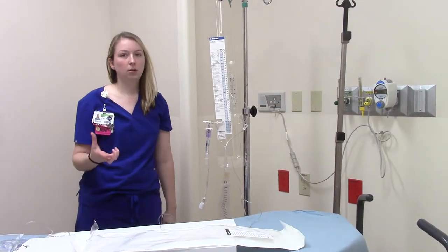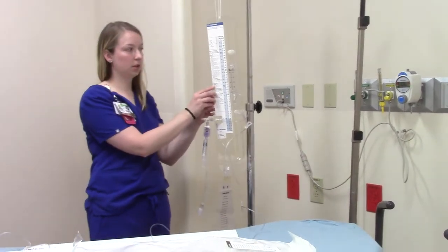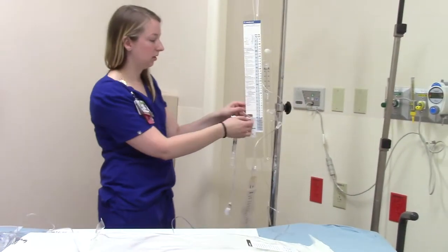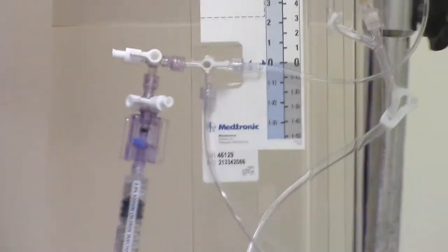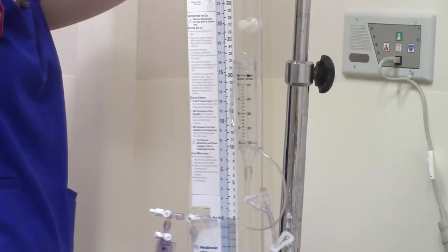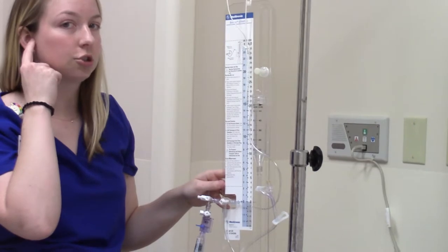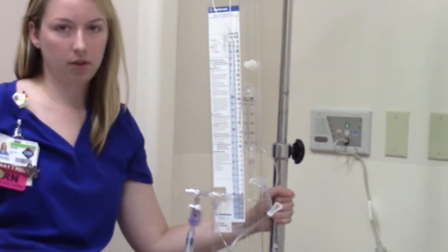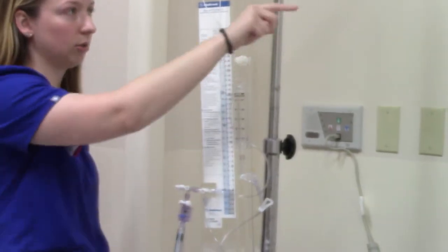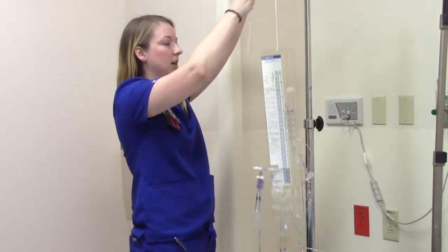The way that we zero our art lines is the transducer at the level of the heart. For this, it's going to be at the level of the tragus — that's your measurement right here. You can see this little arrow; it will adjust up and down, and you'll want to slide this until these little arrows are at the patient's tragus. It's really helpful to have a separate IV pole to do this, though you can do it from a bedside pole — just loosen or tighten this cord.